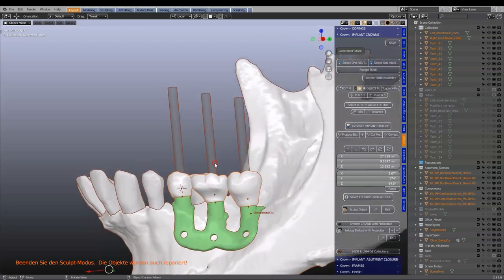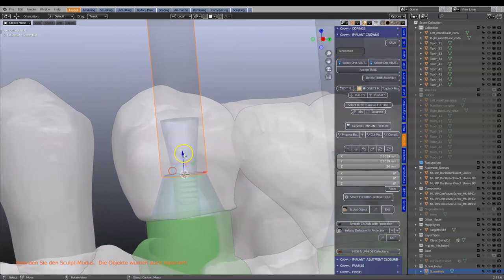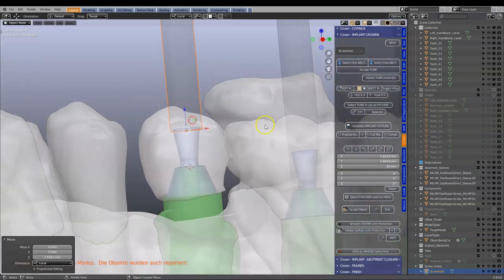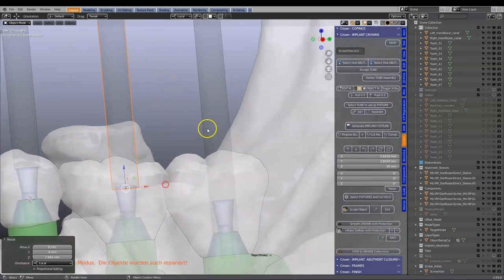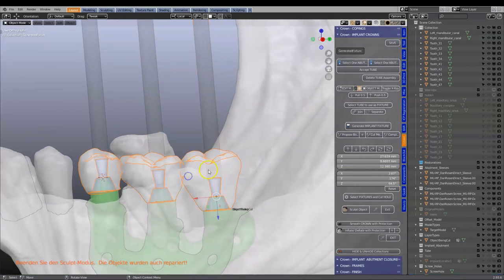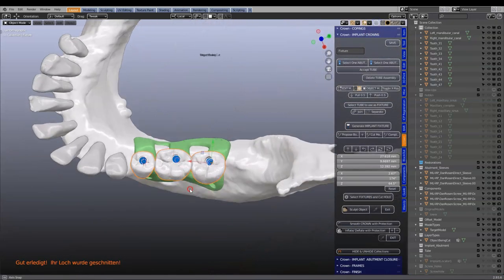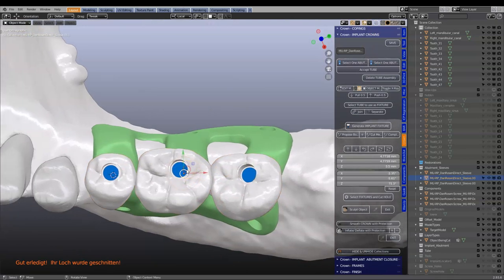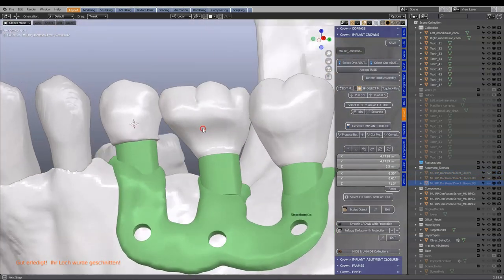Lastly, let's make a few holes. We're going to move this up, then select the bridge, select fixtures, and cut hole. That's about it. The blue ones are spare so we can use them again if needed. That's our completed unit.